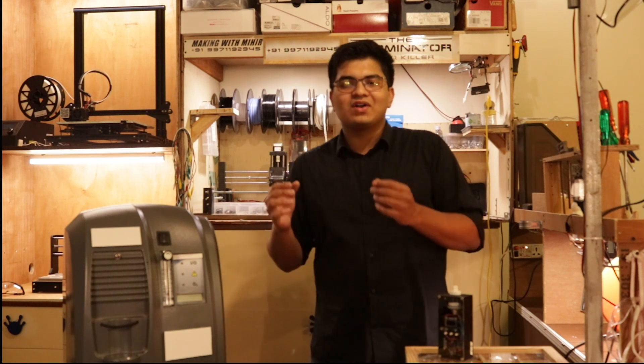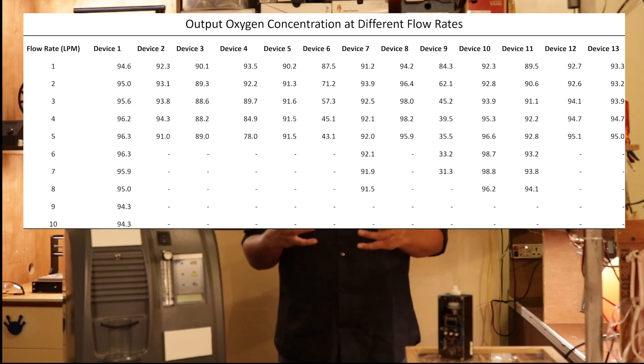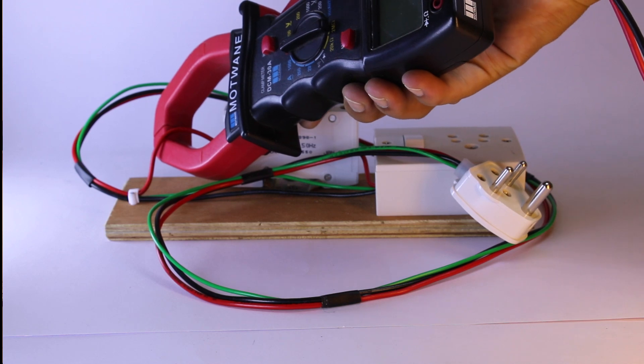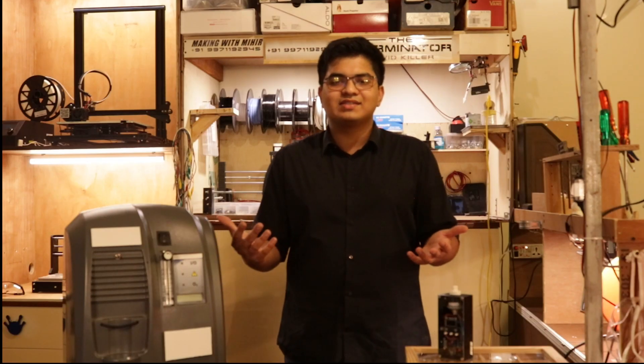I did this 13 more times and got this beautiful set of data. Since I was testing the oxygen concentration of these machines, I decided to also check their current draw and weight as indicators of the compressor used inside the machine. To measure the current, we used a simple clamp meter I could clamp onto this little extension board I made. And to measure the weight, I just used a simple bathroom weighing scale.